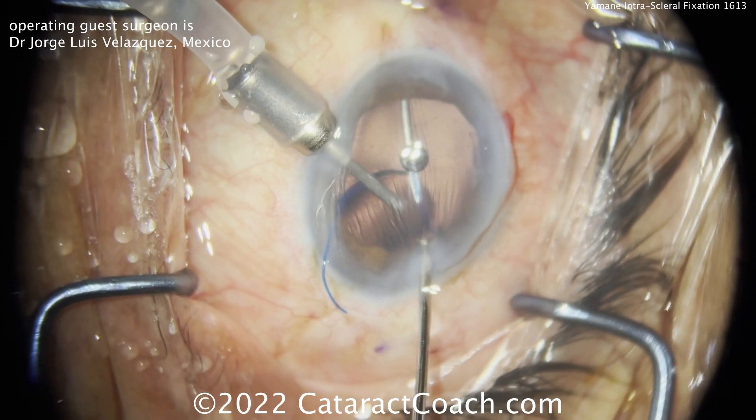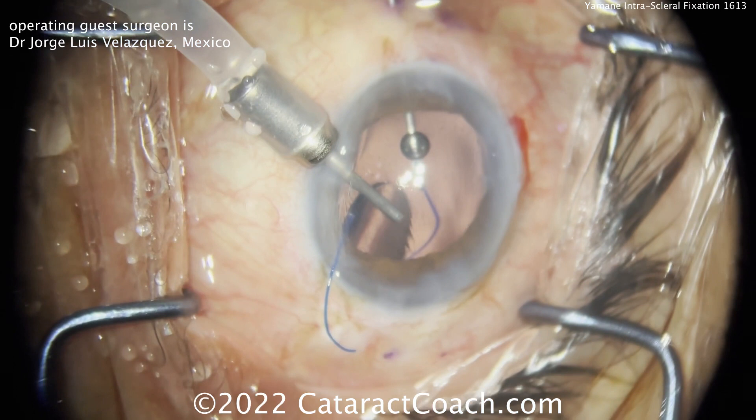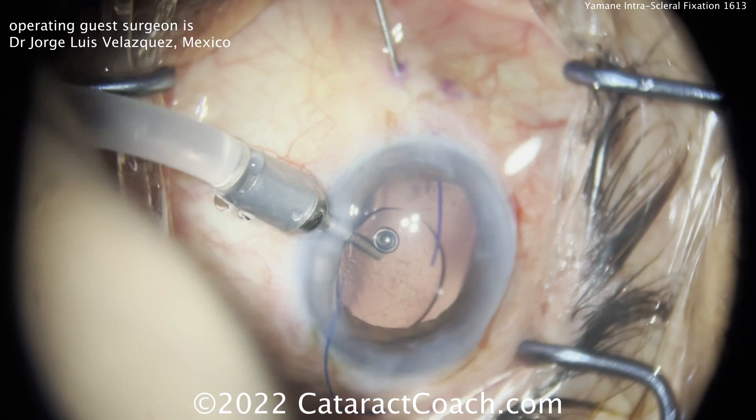This technique makes it significantly easier to manipulate those haptics and get them in the appropriate position without the risk of the lens falling back or dangling too much in the mid-vitreous. The lens optic is a little bit posterior here, and if this were an eye that didn't have a thorough vitrectomy, that could entangle some vitreous strands.